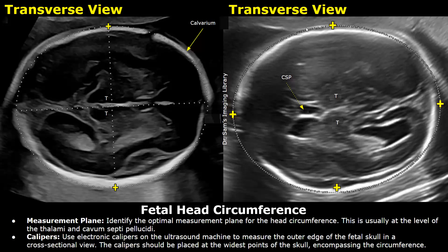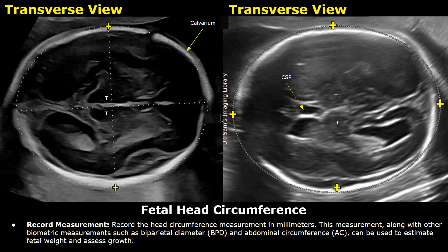Place the calipers on the outer edge of the fetal skull in a cross-sectional transverse view in this manner. This is the method for measuring fetal head circumference. The fetal head circumference is measured in millimeters.